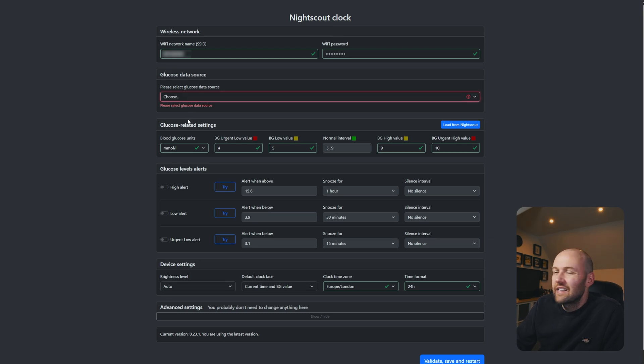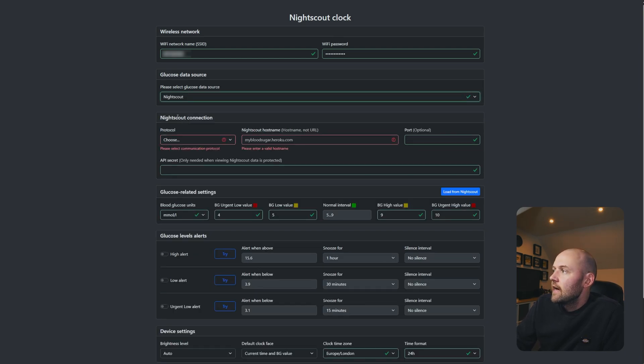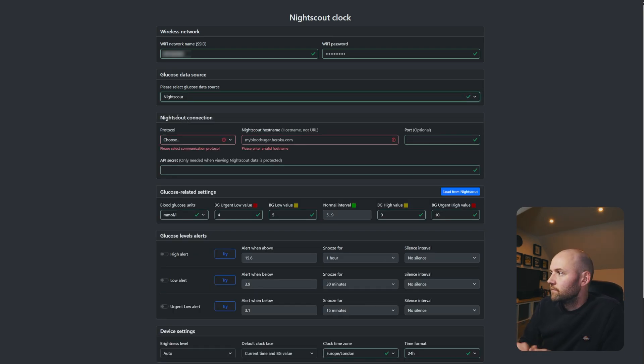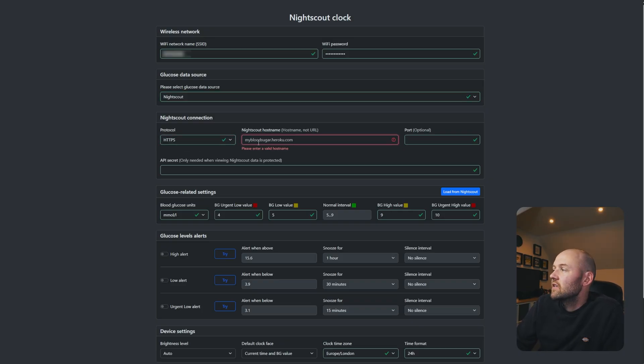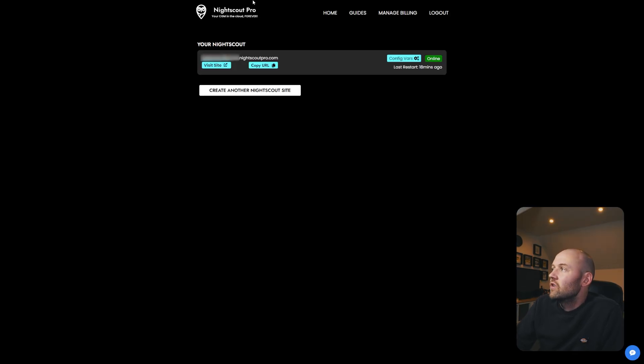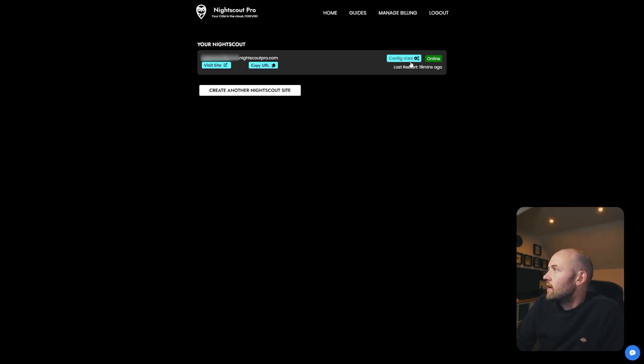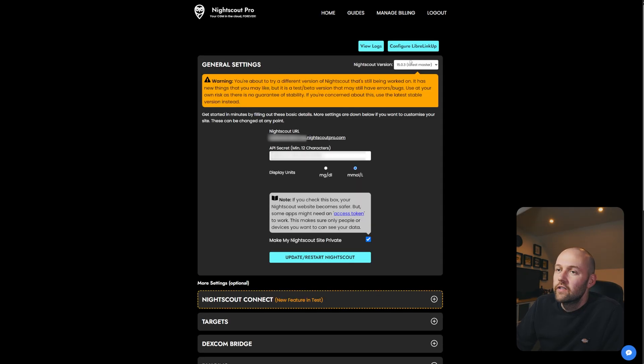So from the dropdown we're going to select Nightscout from the list and it'll give me a few more options to fill out. The first one's going to be the protocol. Since I'm using Nightscout Pro I'm going to be using HTTPS. The next part is the Nightscout hostname. In order to find that you have to go to your actual Nightscout Pro account page and then I click on configure vars here.